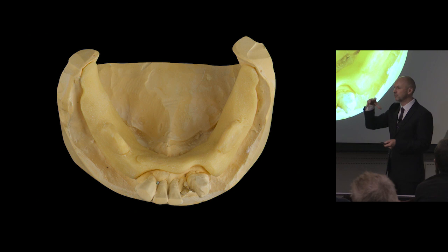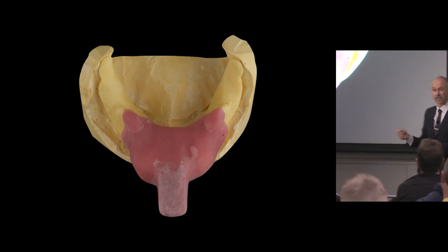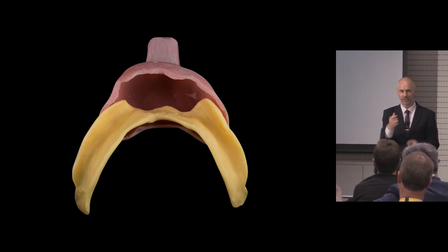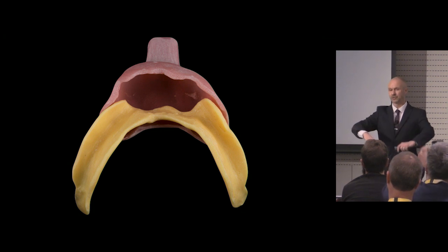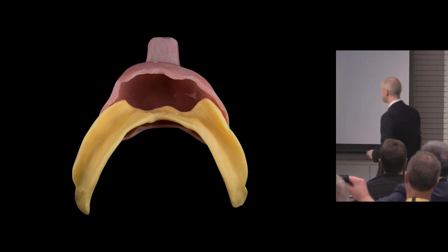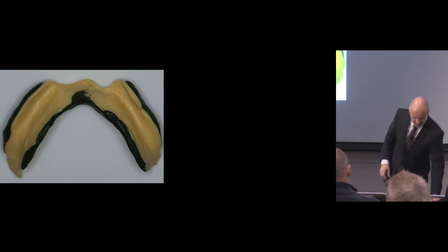And Rowan will make a separate over tray over that, like that, and it just fits on. I'll take it out of the mouth so you can photograph it. That's why I turn it round. So it's literally just like a whole tray, and actually the handles all slot together as well, the over tray. This enables me to take a lower impression without those lower front teeth getting in the way.